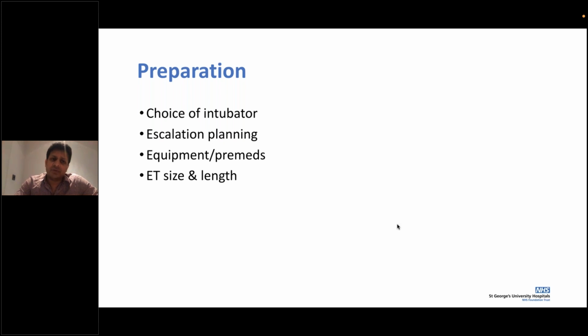Always have a rough understanding: if you haven't intubated before, are you the right person? Quite often within the unit, there will be a discussion about who is going to intubate, and we'll talk a bit about who should be the first person to offer.